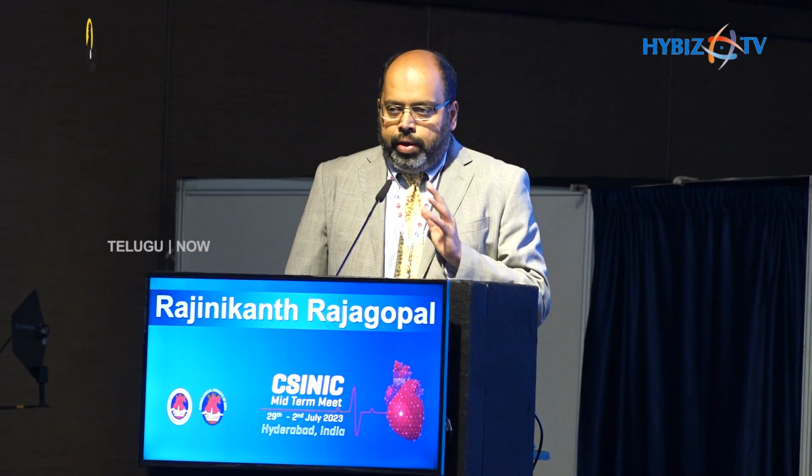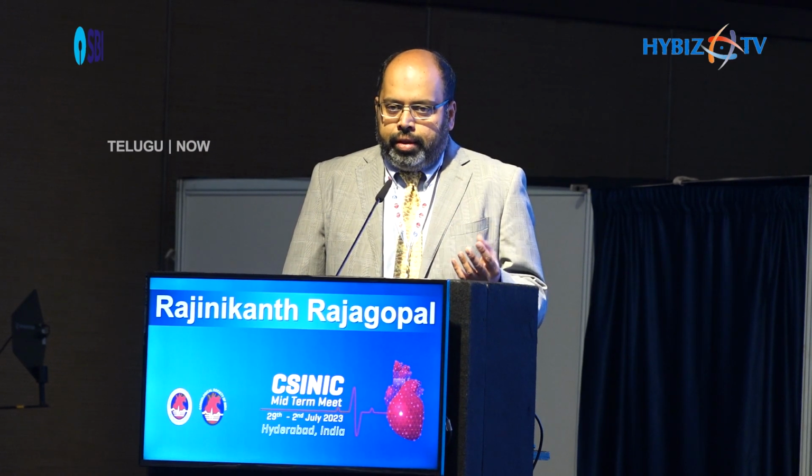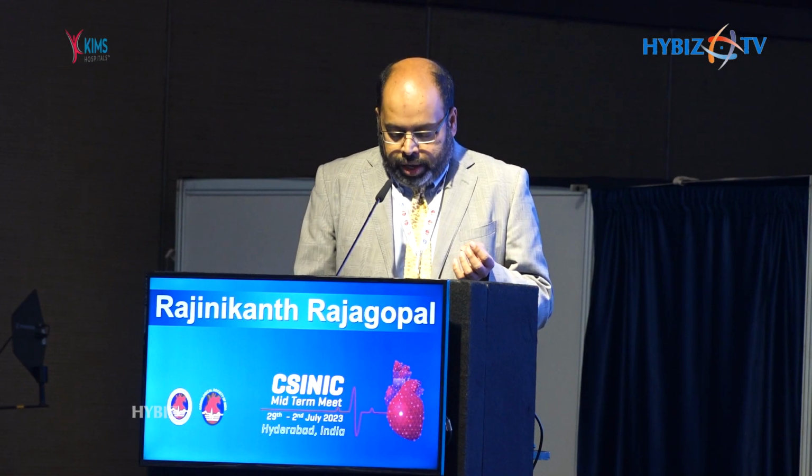And you see similar images on the right side with IVUS. For example, on the right extreme, you see neoatherosclerosis with calcium on the IVUS. But if you see these images on the angiogram, all you can see really is luminal stenosis. You will not be able to see the mechanism, and therefore we travel blindly when you do PCI with just balloons. And is there evidence to support imaging in ISR?